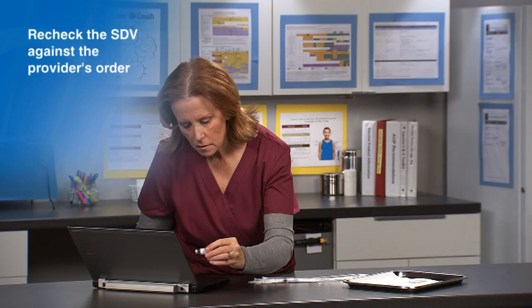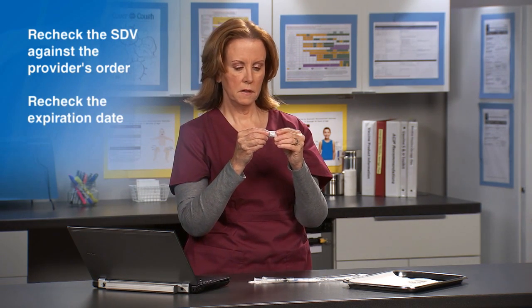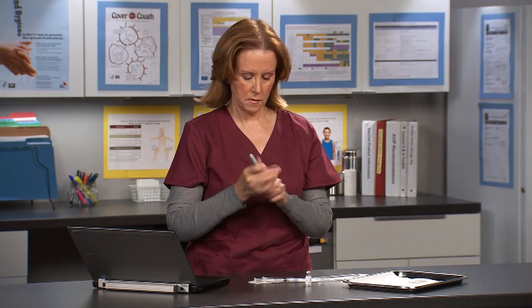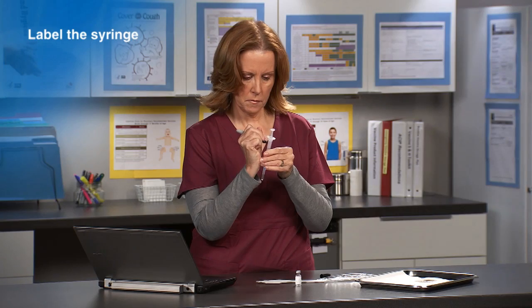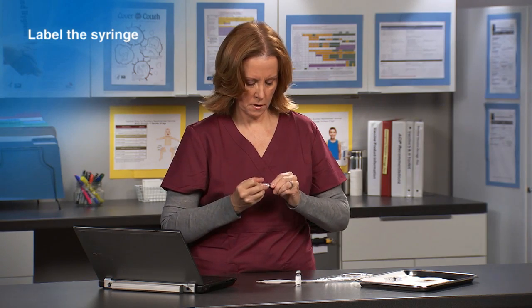Recheck the single-dose vial against the provider's order and recheck the expiration date. Once in the syringe, many vaccines look alike. Label the syringe with the vaccine name or abbreviation. Retain the vaccine vial if necessary for documentation.